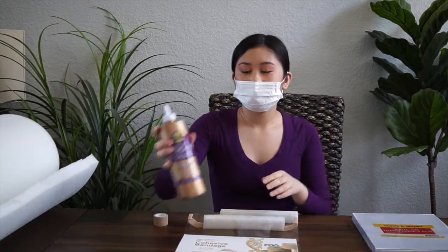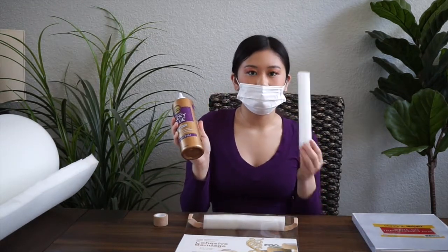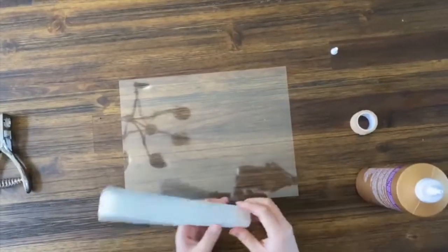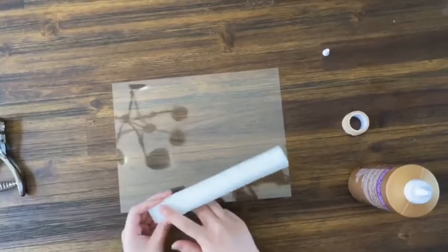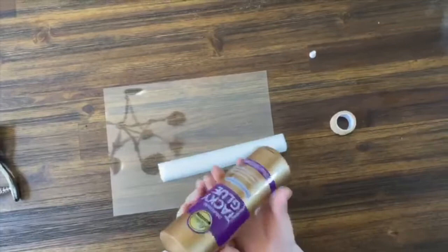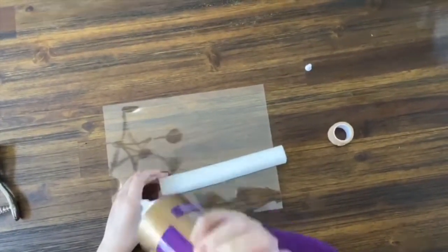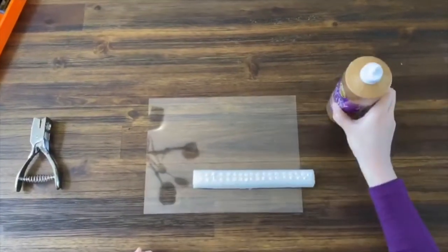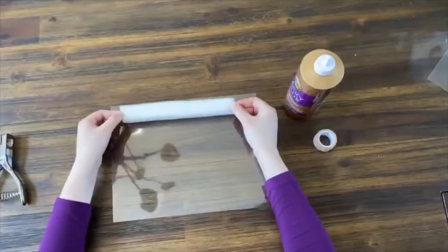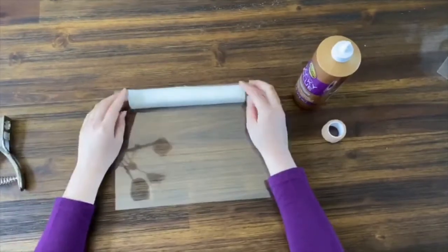You're also going to need tacky glue or just a strong glue of some kind to be able to adhere the foam to the transparent sheet. So the first thing you're going to do is glue the foam to the transparent sheet. You're going to take the flat side of the foam and put little dots of glue throughout the foam stick. After you put the glue on it, you're just going to place the foam stick about center toward the top, because this is what's going around the forehead.